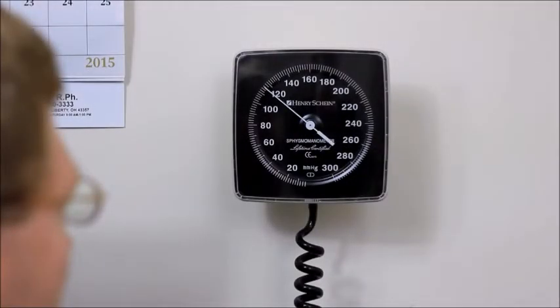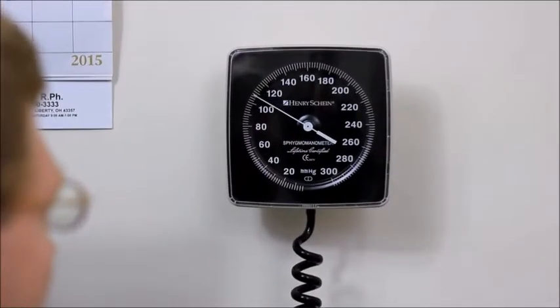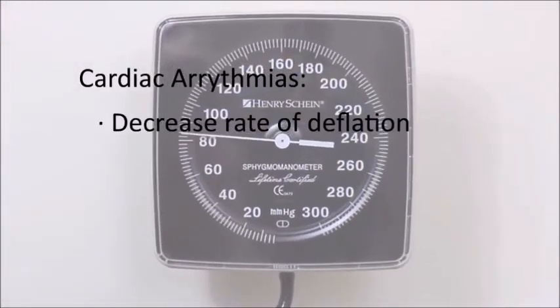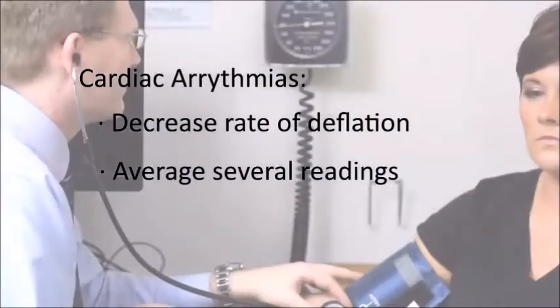Certain conditions, such as cardiac arrhythmias, may complicate blood pressure measurement or interpretation. In these circumstances, decreasing the rate of deflation and averaging several readings may improve accuracy.